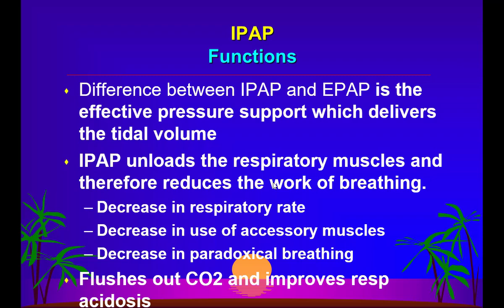So IPAP may not be so important in patients with hypoxemic respiratory failure or in congestive heart failure patients. IPAP would be useful only if the patient has hypercapnic respiratory failure, which occurs in patients with COPD, obesity hypoventilation, neuromuscular disorders. I think you understand that?